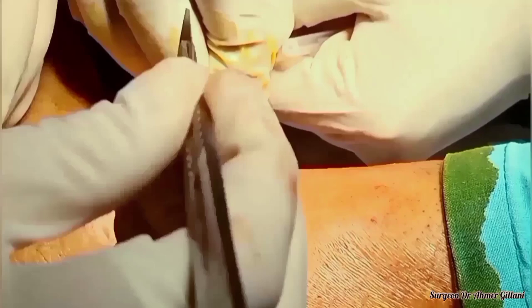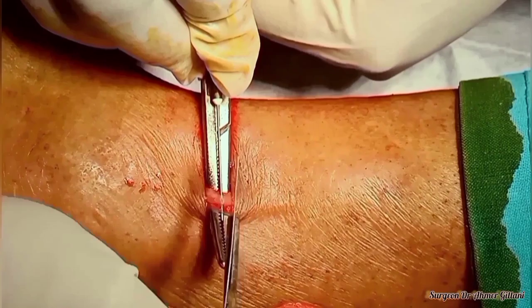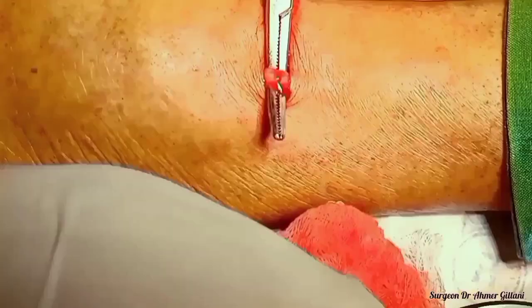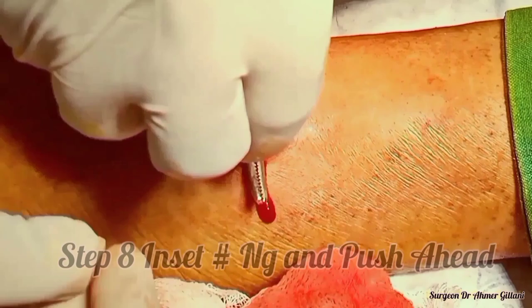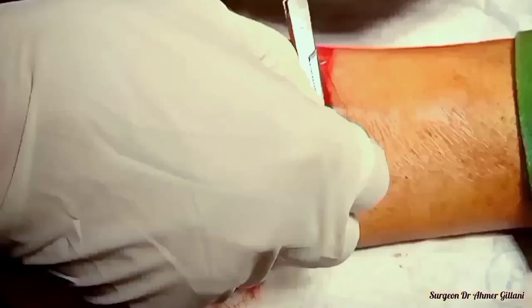We will cut with the help of a blade, and only the anterior surface of the vein — we will protect the posterior surface, otherwise it will cut the vein all the way through. So we have done this procedure as you are seeing on the screen. When the hole is formed, we can put a number six NG tube into this hole gently and softly, advancing it in the direction of blood flow.